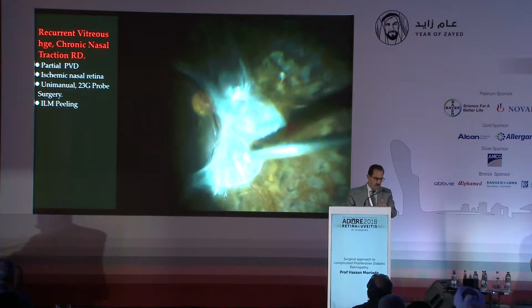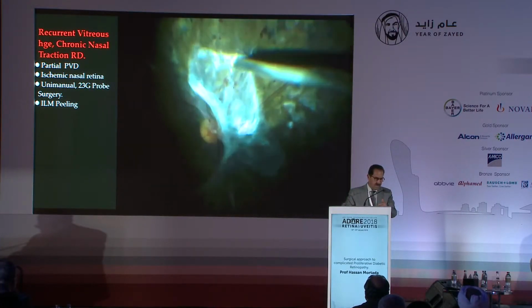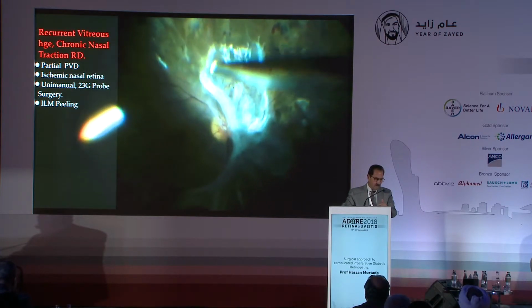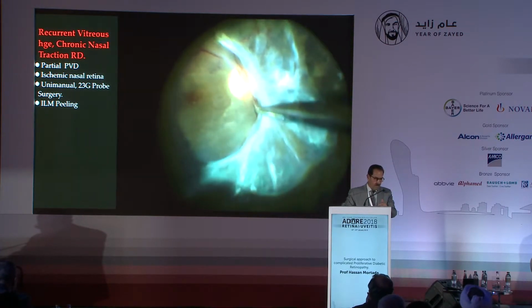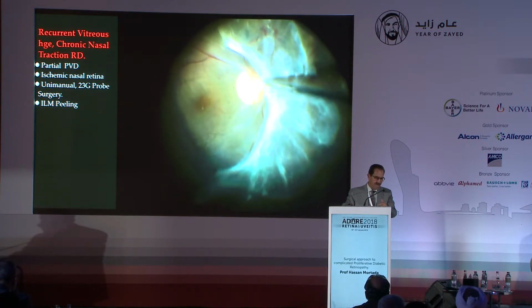Here you cannot go under the retina, so you have to find another way. And the only way is, again, to work from the center to the periphery, detaching the fibrovascular tissue from the disc in order to find the proper cleavage plane. So when you fail to find the cleavage plane in the periphery, go ahead and detach it from the attachment to the optic disc.